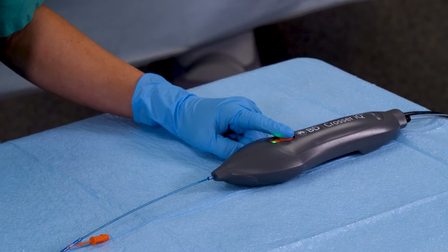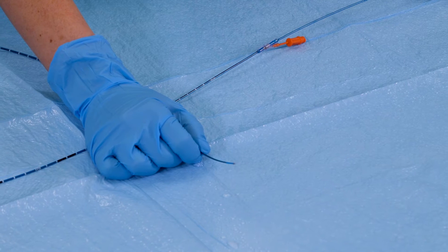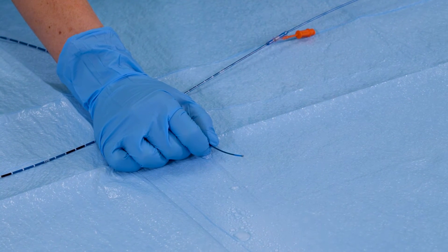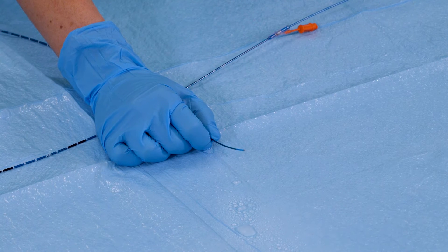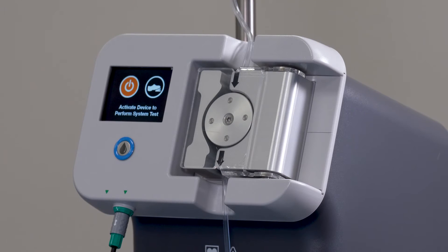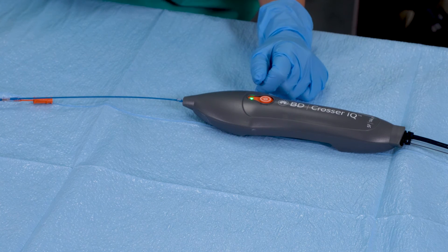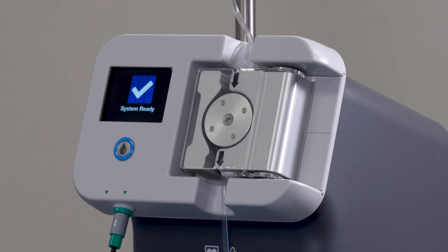Lastly, perform a system test. Push the on/off handle activation button or footswitch — not both — and verify that irrigation or saline misting is taking place at the distal tip of the crossing catheter for a minimum of three seconds. The LCD screen will guide you by displaying 'activate device to perform system test' and 'ensure misting at tip to confirm device function.' When the green LED on the Crosser IQ Ultrasonic CTO device handle is illuminated and the LCD screen says 'setup complete,' you will have completed the simple plug-and-play setup of the Crosser IQ CTO recanalization system and are ready to go.